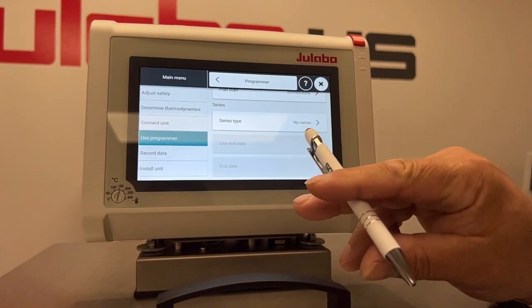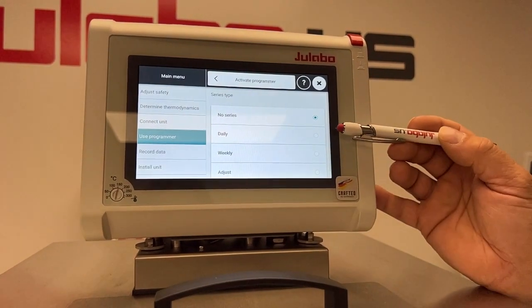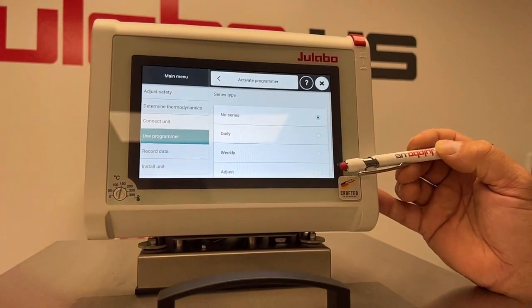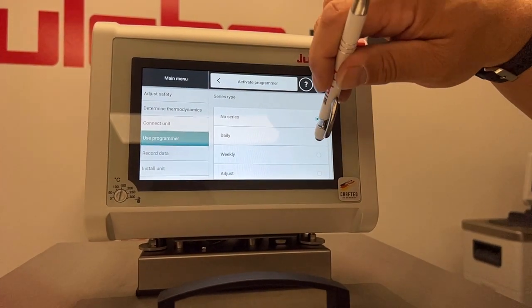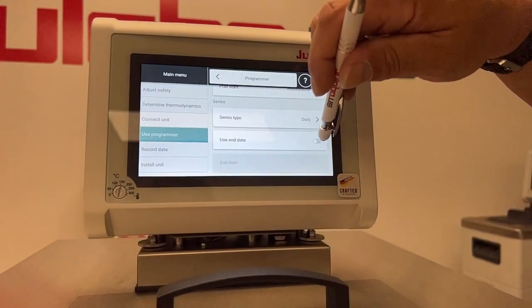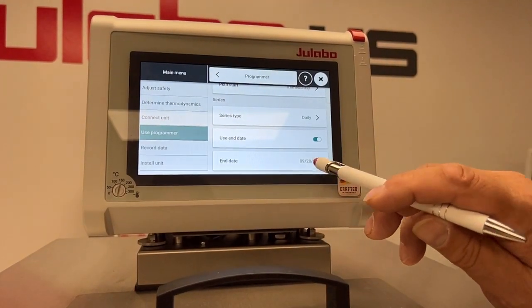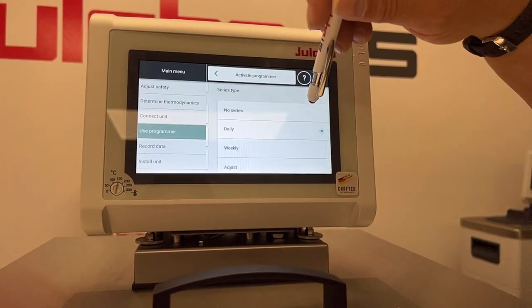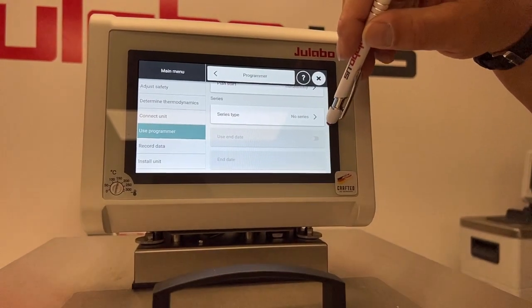You can also program a series, which means you can have it run the same profile daily, weekly, or you can set a custom. So if you wanted it to run daily, you would set daily, and then you can use an end date and select a date when you want it to stop running. I'm just going to select no series.